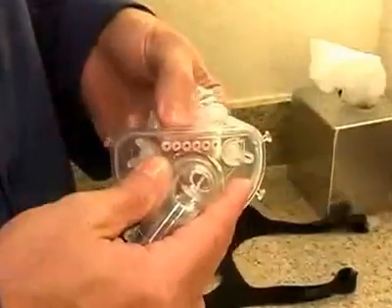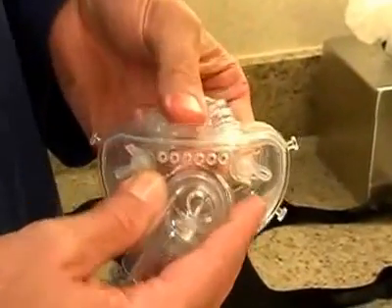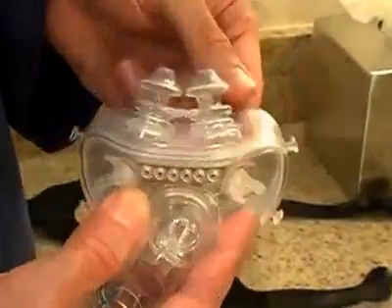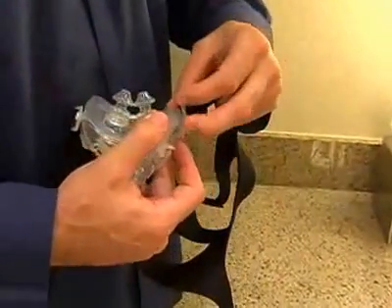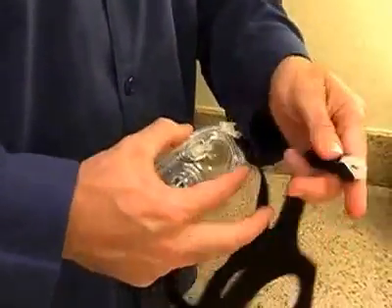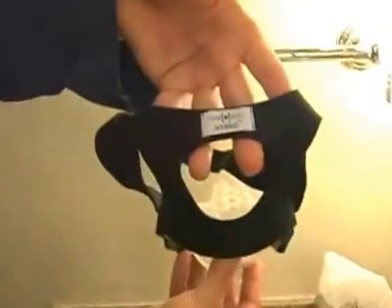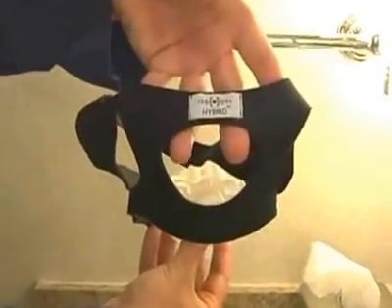Attach the cushion to the shell by inserting it into the groove of the shell. Attach the headgear by snapping the quick-release buckles of the headgear onto the posts of the mask shell. Note that the label on the headgear should face outward and up.